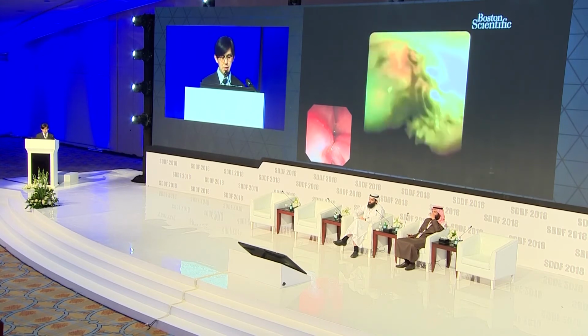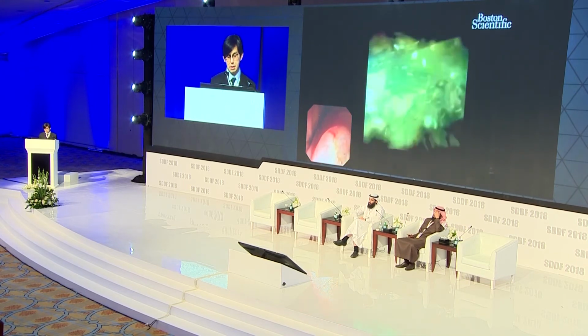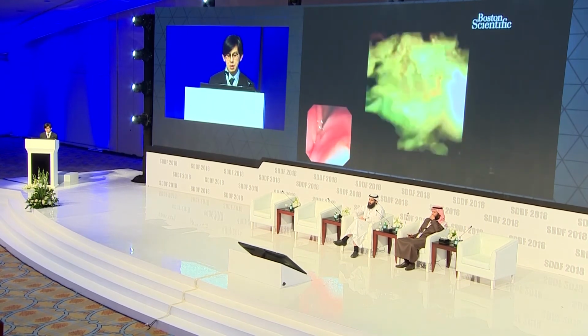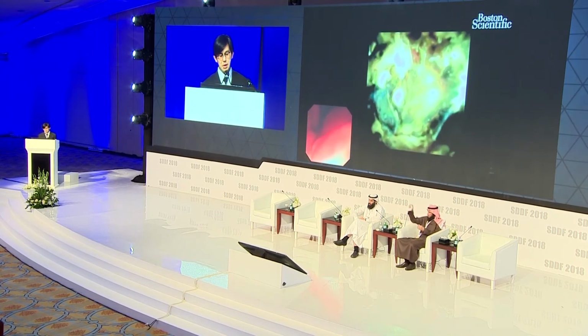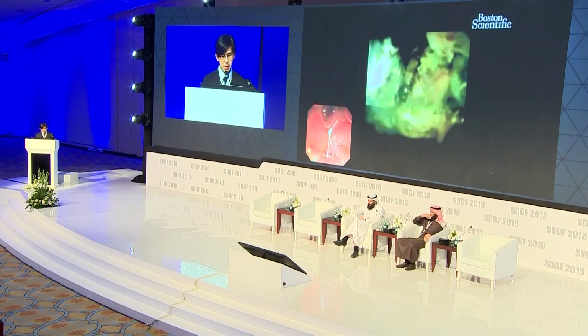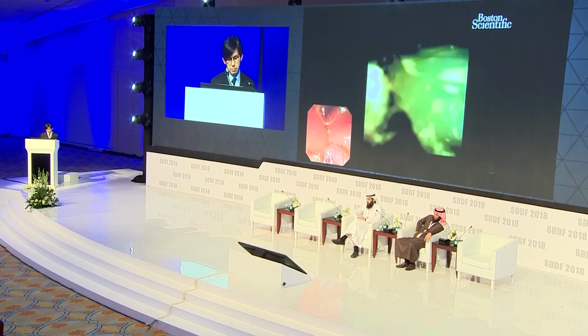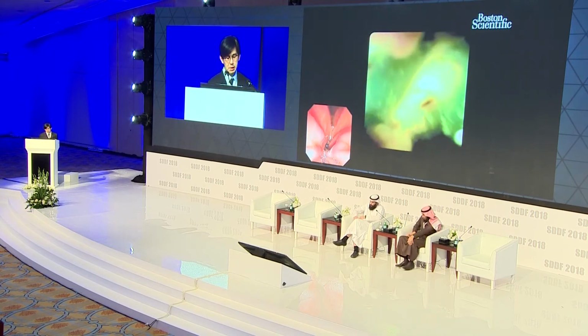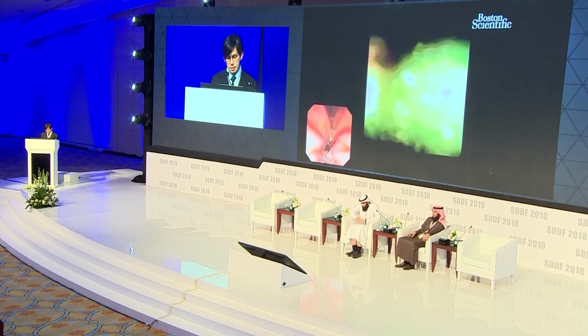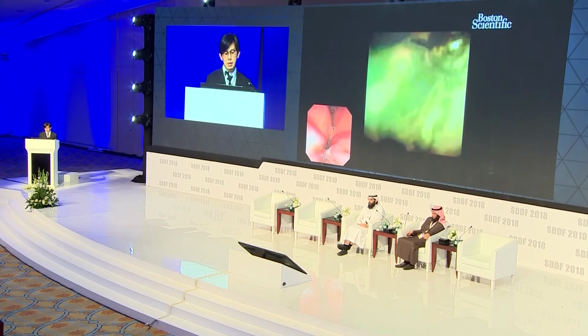And this is what we saw with the SpyScope. We are actually at the hilum with multiple calculi, and this is a case of recurrent pyogenic cholangitis in a young patient with numerous calculi packing both intrahepatic ducts. And this patient, without treatment, would slowly go on to a form of cirrhosis, and we went on to treat the patient with endoscopic means.